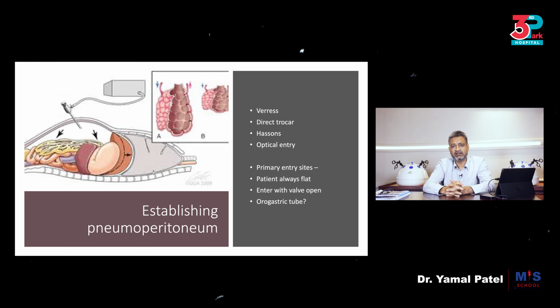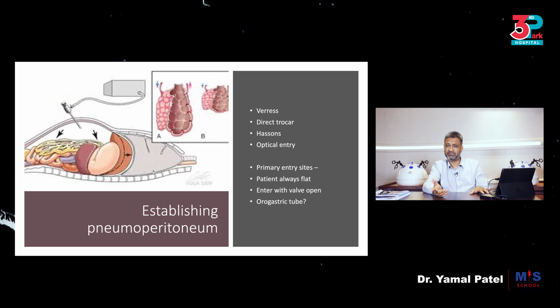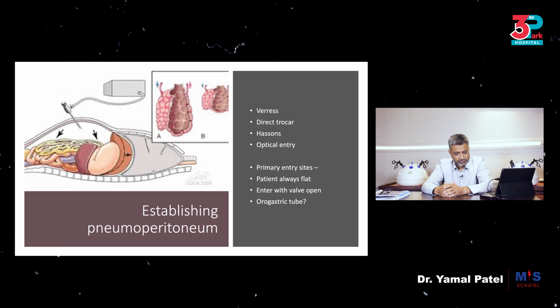You can consider an orogastric tube or a nasogastric tube for that matter if they had a difficulty during intubation and needed to actually bag the patient quite a bit. So you empty the stomach in such a case.